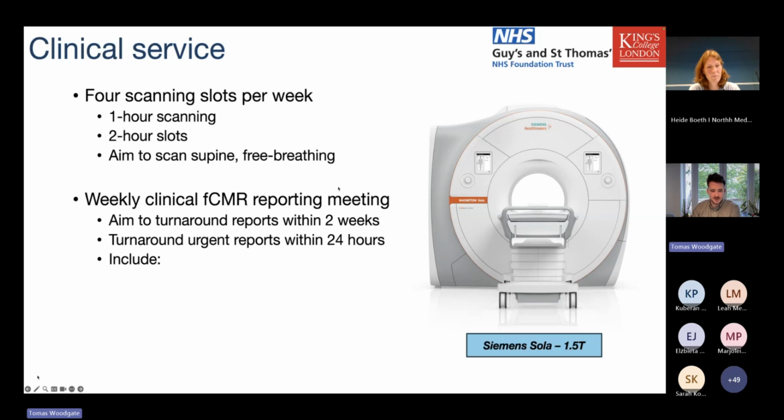For our reports, we would always include several things. We often include vascular measurements if relevant to the diagnosis we're looking at, and also flow data. And the main thing for us, I'd say, is lots of images. These can be really helpful to provide visualization of what we've seen during our scan.